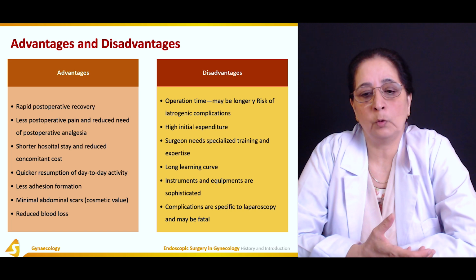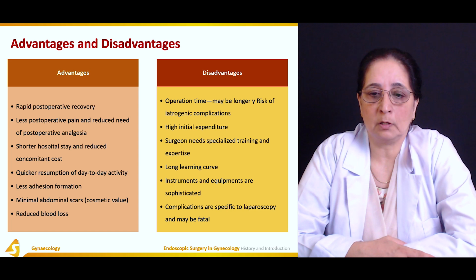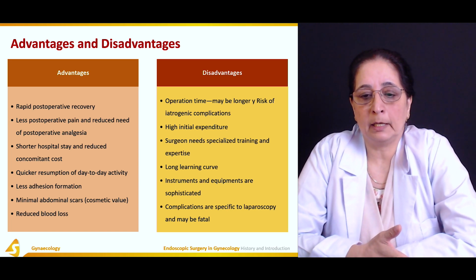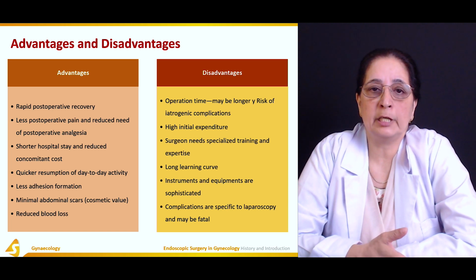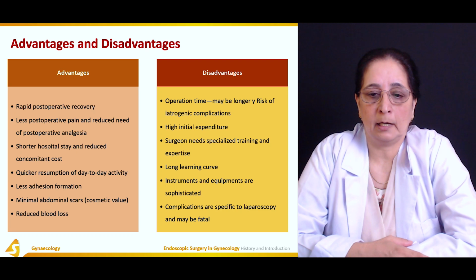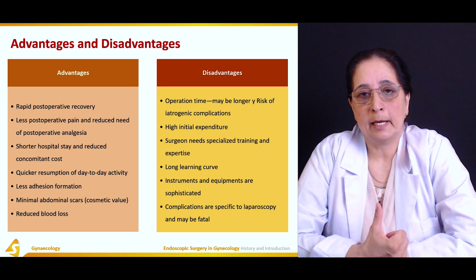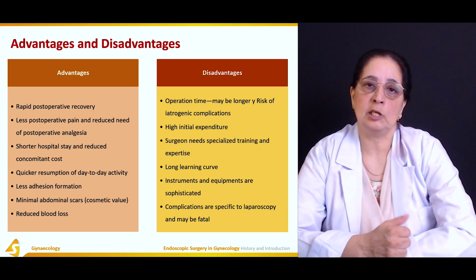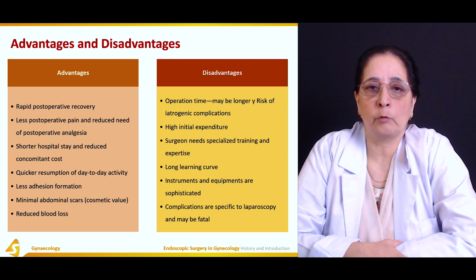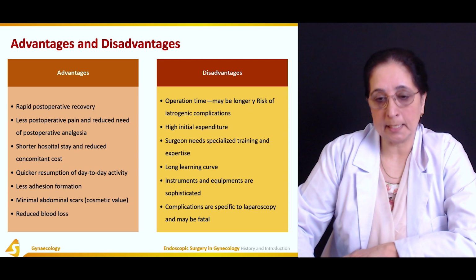This requires special equipment and training of the doctors, and again complications, which sometimes can be very fatal, can occur. So the disadvantages are mainly complications, expenses on the treatment, and expenses on the training of the doctor, because they require special training and equipment. So both advantages and disadvantages.